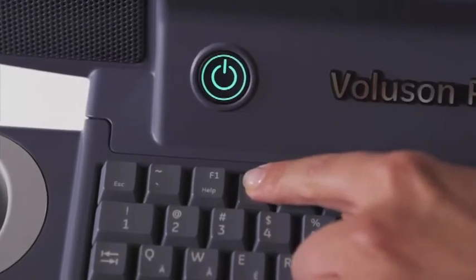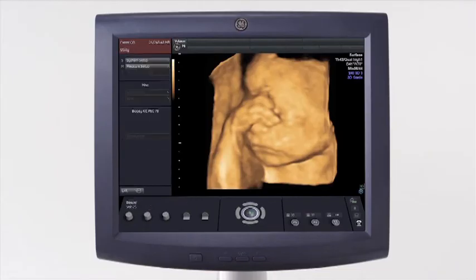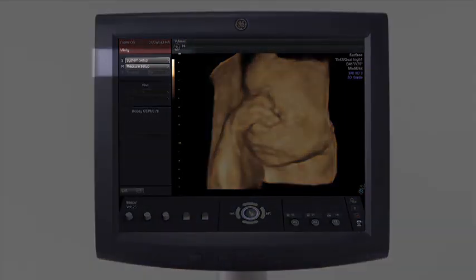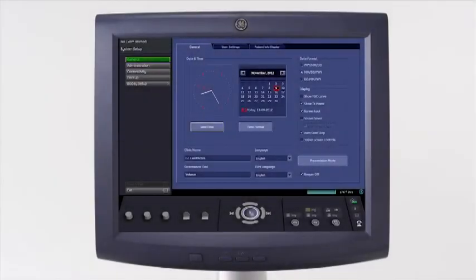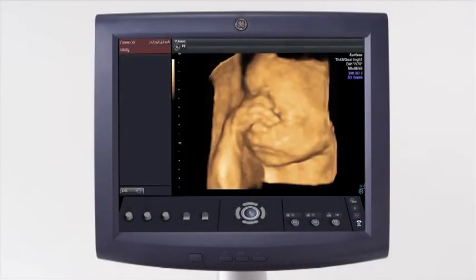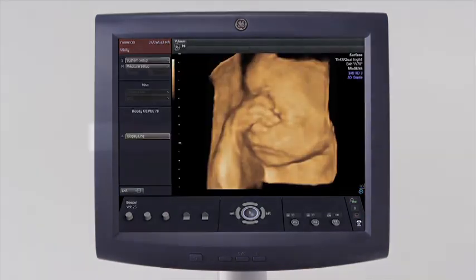The utility key on the alphanumeric keyboard will bring up options on the display menu. To customize items such as Annotations library, presets, print keys, and any other configurations, select System. To customize the measurement packages and options, select Measure. The utility menu is also where biopsy lines can be activated.